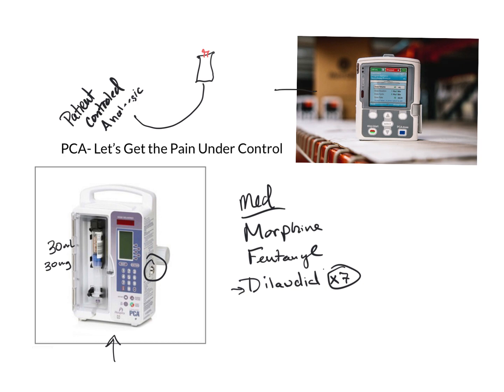You see this little guy over here, that's a CAD pump. This is what I used to use with my home infusion patients. So you've got somebody with bone cancer, or I have an aunt with scoliosis, and her rib cage is really not stable, and so she has a lot of pain. She uses a little CAD pump, and you can program it to give the morphine, all that kind of stuff, same thing, but it is one where it's at home. She carries this at home. It's a little bit bigger than maybe a cell phone, but there'll be tubing coming out of it and connecting into a patient, and they can control their pain that way. So we have some different options.